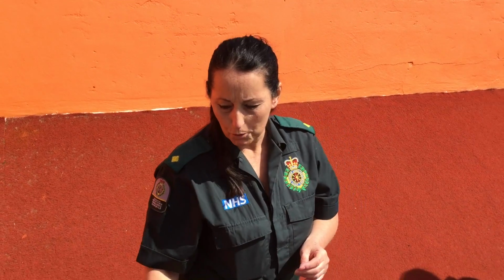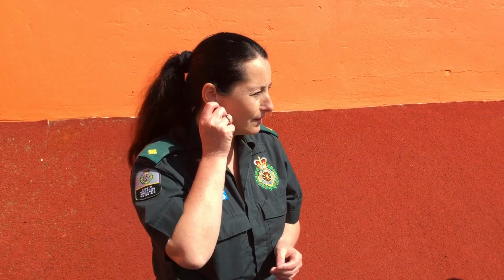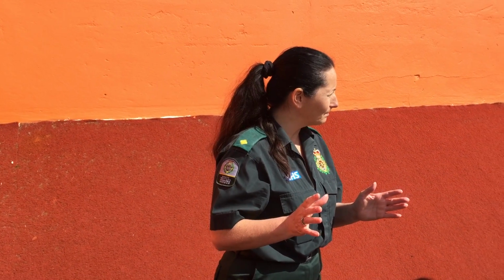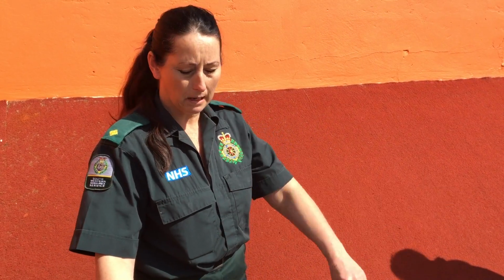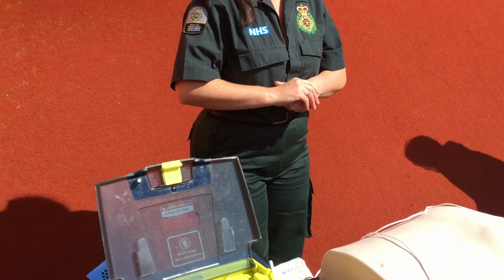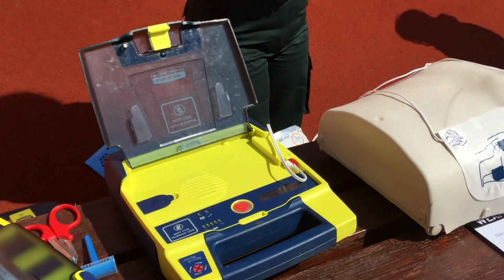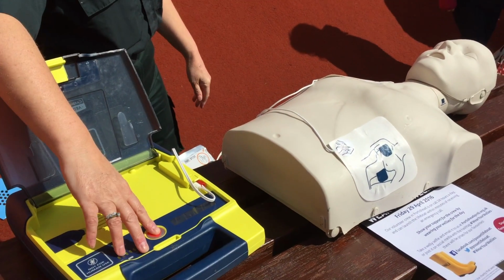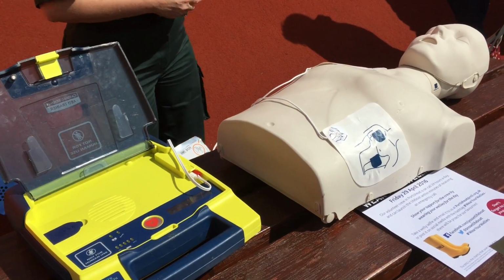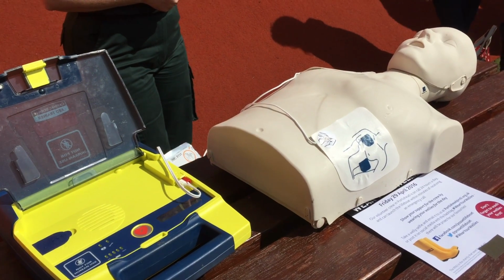Alright? So at 2 minutes, the machine will say to you, Do not touch patient. Analyzing rhythm. So now it's reanalyzing. Everybody clear? Shock advised. Charging. Stand clear. Push flashing button to deliver shock. Okay, everybody clear? Shocking. Shock delivered. It is now safe to touch the patient.